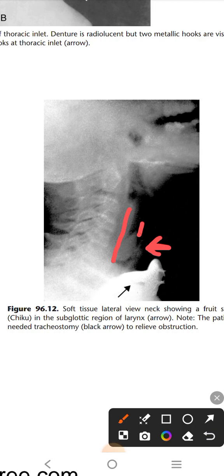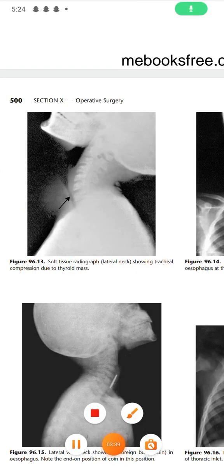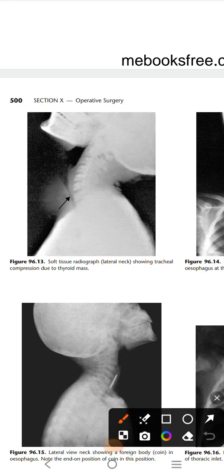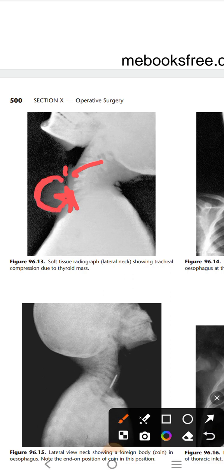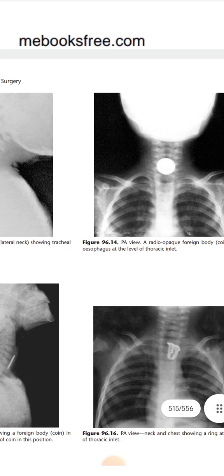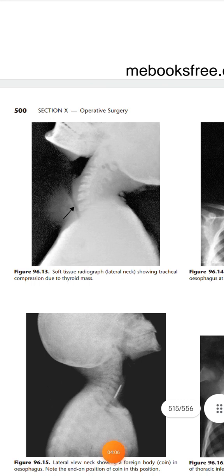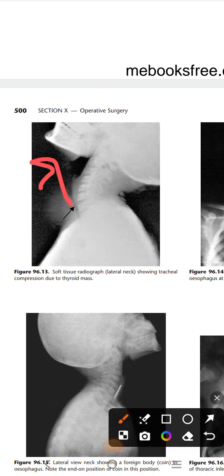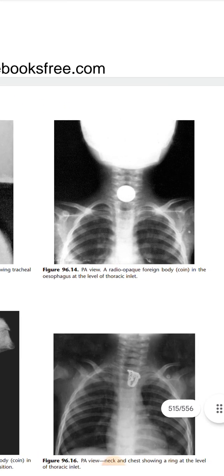In the next image, the arrow is pointing to the esophagus and the trachea is shown in black, but the trachea is compressed at the region where the arrow is shown. This compression is due to a thyroid mass shadow. This type of mass cannot be seen clearly on x-ray alone, but the thyroid is enlarged here so its shadow is also increased.